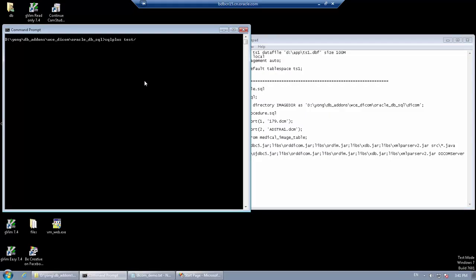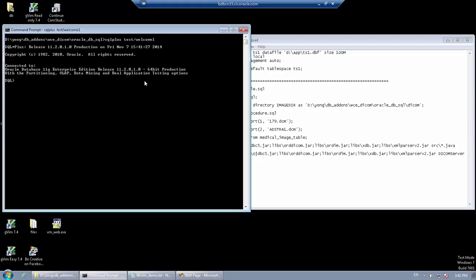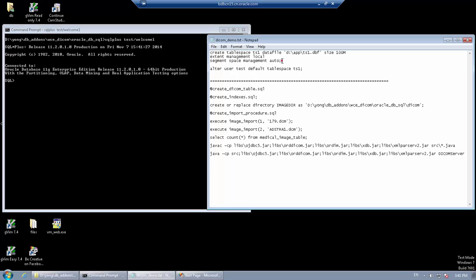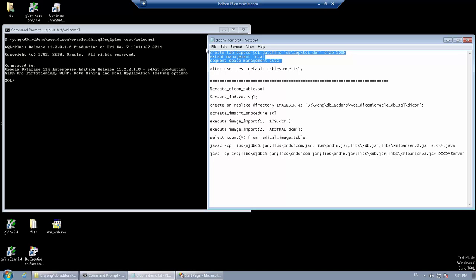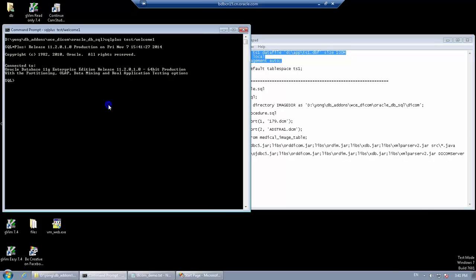Our sample program requires an Oracle database instance with DICOM extension installed. The sample table requires a table space with automatic segment space management. We can create one for this user.